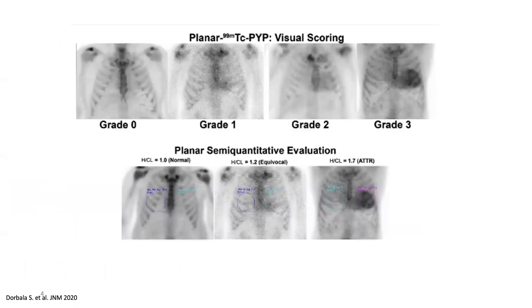As for the planar semi-quantitative evaluation, we can draw a region of interest around the heart and on the contralateral hemithorax. According to the ratio between the heart and the contralateral region, we can define the different grades. A ratio equal to 1 represents a normal scan; a ratio of 1.2 is equivocal, similar to Perugini 1; and a ratio higher than 1.7 indicates positivity for amyloidosis.